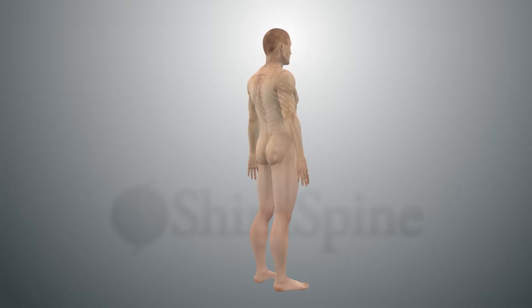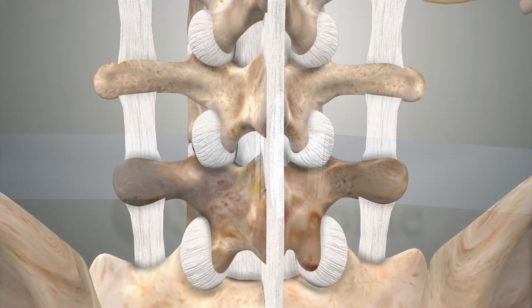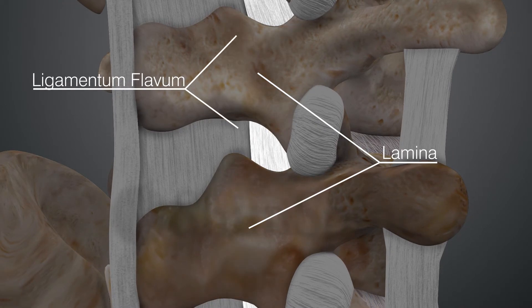Care is taken to preserve the posterior spinous ligament and minimize stripping of the multifidus muscle attachments. Muscles are gently retracted to allow visualization of the bony covering or lamina and the ligament that covers over the spinal canal, known as the ligamentum flavum.